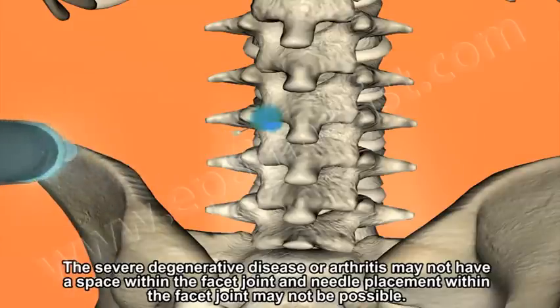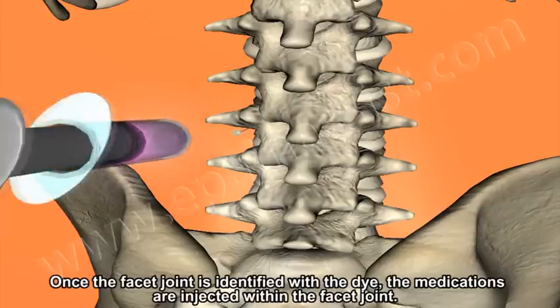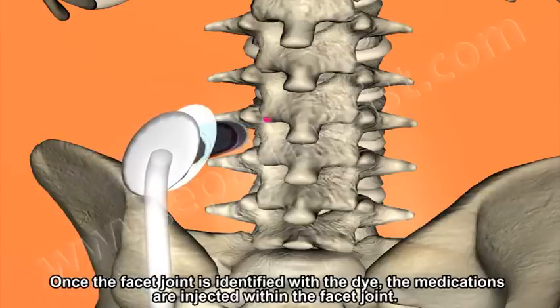A severe degenerative disease or arthritis may not have space within the facet joint, and needle placement within the facet joint may not be possible. In this case, the injection is performed at the top of the facet joint so the medications are spread over the facet joint. Once the facet joint is identified with the dye, the medications are injected within the facet joint.